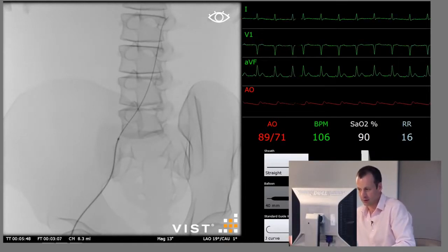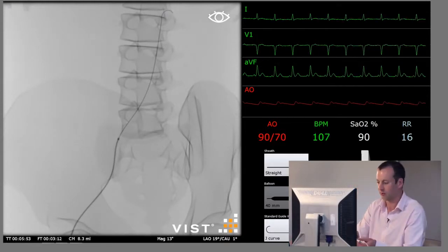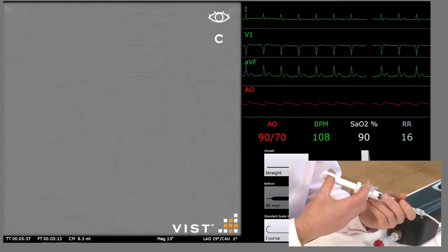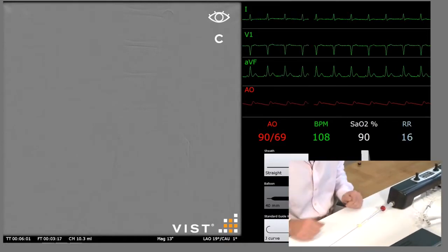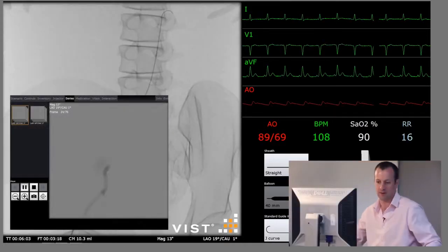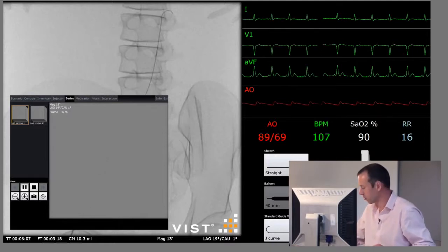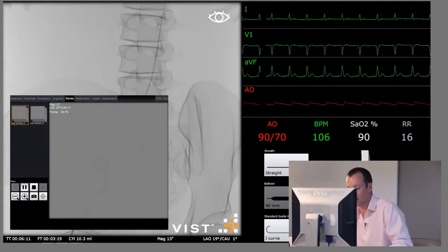But important, in fact critical, is you leave the balloon on the guide wire at this stage. Don't take it off the wire. So we're just going to inject through the sheath. We don't need to be above it. And we're going to inject hard. And in fact you can see contrast extravasation. The patient's bleeding from the midpoint of the treated vessel. So we've got a problem here. This patient has ruptured their common iliac artery, and at this stage you need to work quickly.